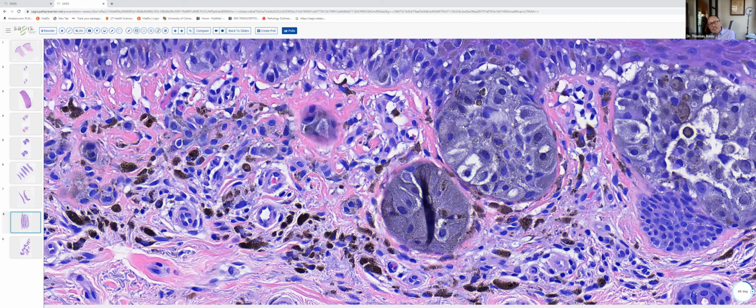And whenever I see this pale gray cytoplasm, it kind of reminds me of a smoking lounge in the airport. You sometimes walk by them and a lot of people are smoking there, and the air in those small rooms kind of resembles this color here. And anytime I see melanocytes on sun-damaged skin with this pale gray cytoplasm that looks like a smoking lounge, I put the brakes on. That's commonly seen in melanoma.